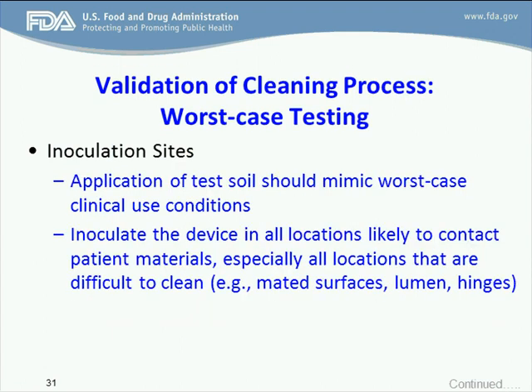The application of the test soil should mimic worst-case clinical conditions, and the device should be inoculated in all locations likely to contact patient materials, especially all locations that are difficult to clean, such as mated surfaces, lumens, and hinges.